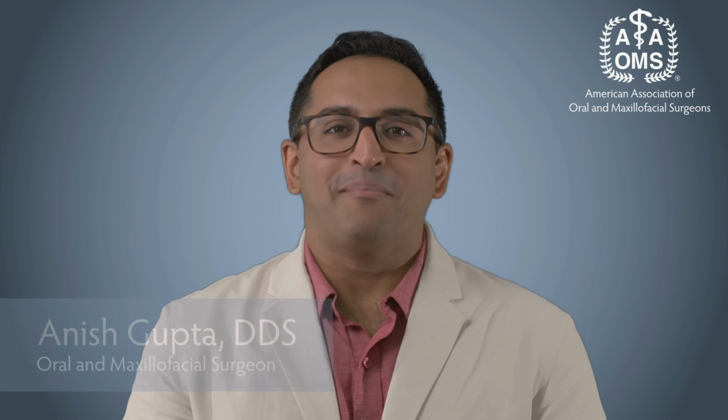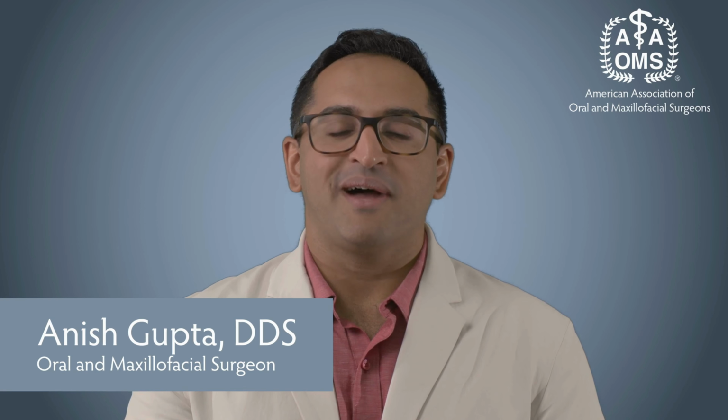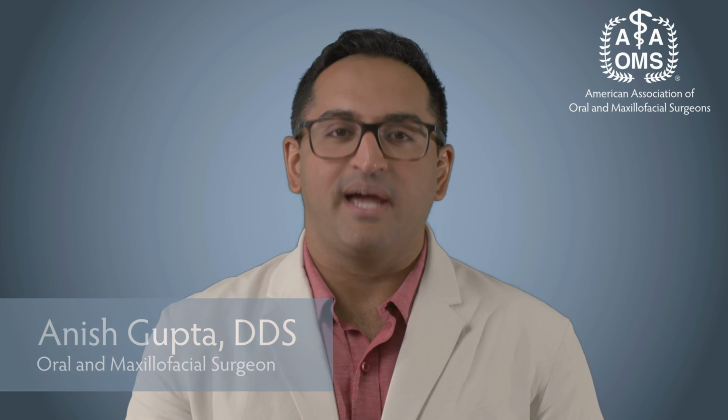Dental implants are a popular solution for restoring your smile and oral function. Endosteal implants are the most common type, placed directly into the jawbone and ideal for most patients. Subperiosteal implants, placed under the gum but above the jawbone, are an option for those with insufficient bone height. Zygomatic implants, anchored in the cheekbone, offer a solution for patients with severe bone loss in the upper jaw.